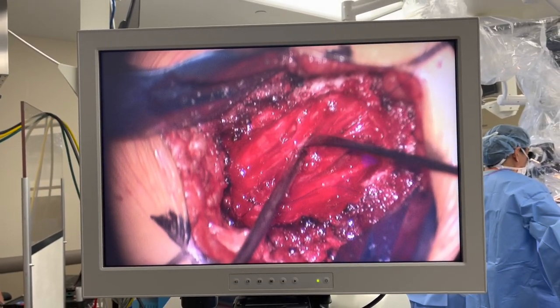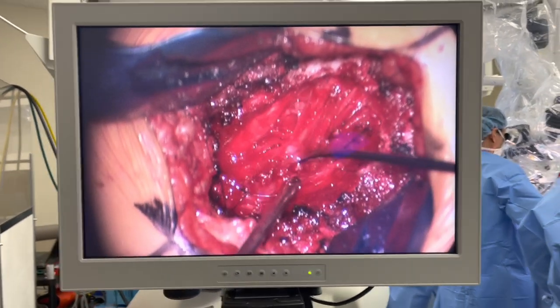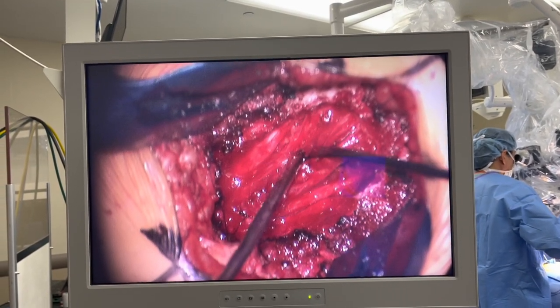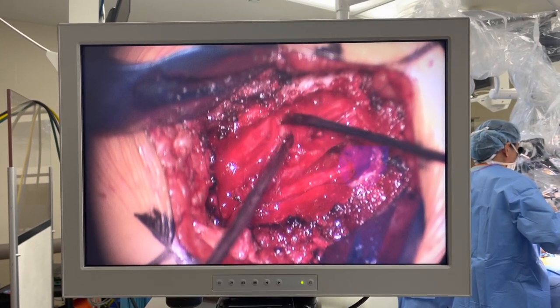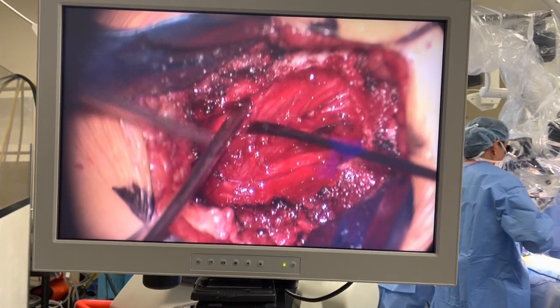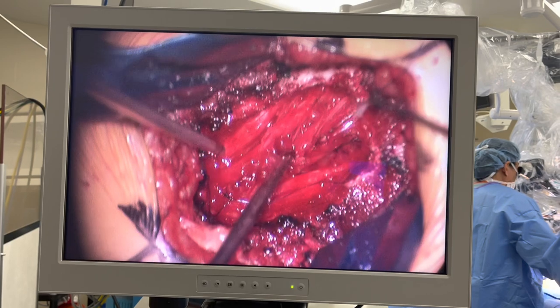Oh, this is such a thing of beauty if you're into this sort of thing, but I don't know if you remember how big this thing was, but look how dainty and svelte it is now. But more importantly, look how stuck down everything is. That is a separate nerve root right there. See that? Look at how stuck down this is. Yep.